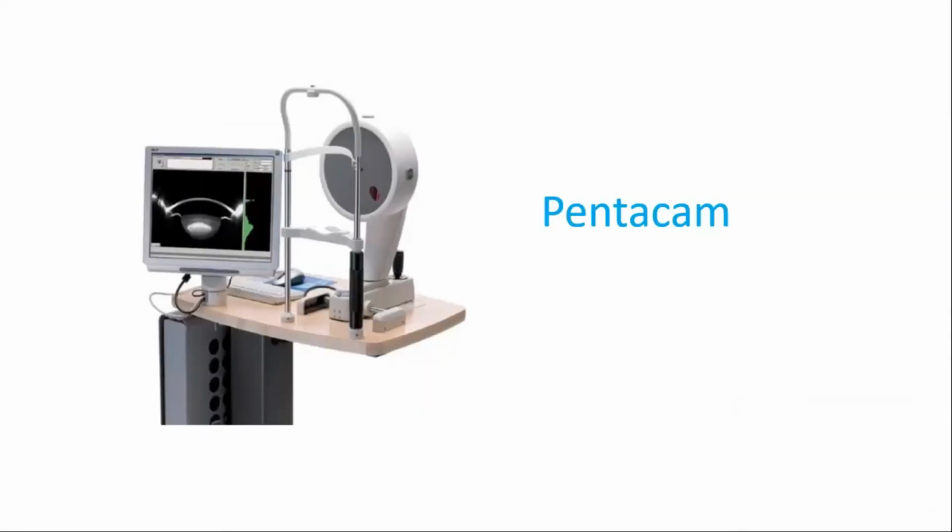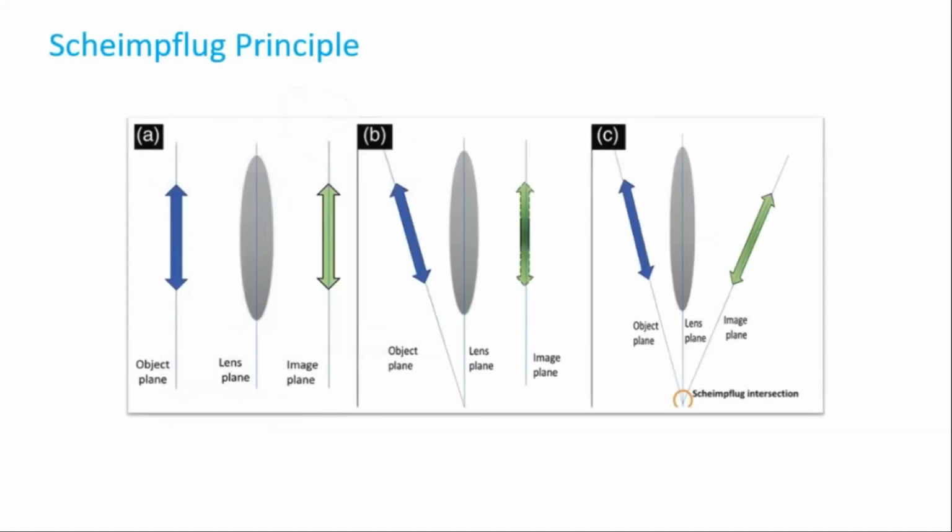Moving on to Pentacam, this machine is based on the Scheimpflug principle. Normally in conventional photography, all the planes, that is the object plane, lens plane, and image plane, are parallel to each other, and they are accurate while measuring planar surfaces. Whereas the cornea is non-planar, so the object plane, lens plane, and image plane should intersect at one point to increase the depth of focus. This is nothing but the Scheimpflug law.